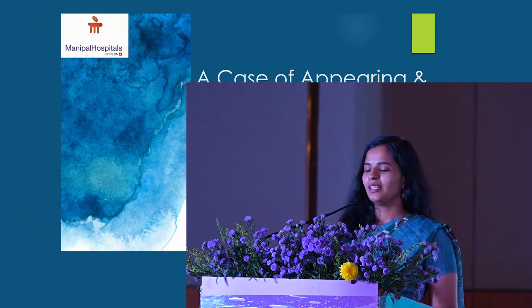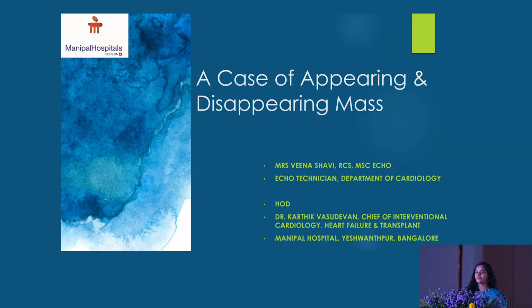Good morning, ladies and gentlemen. My name is Veena Shavi. I'm working as an echo technician in the Department of Cardiology, Manipal Hospital, Yeshwanthpura. Today's case is a case of an appearing and disappearing mass.